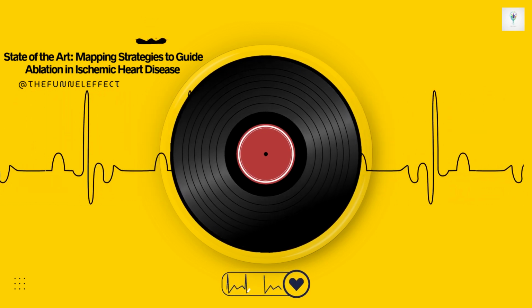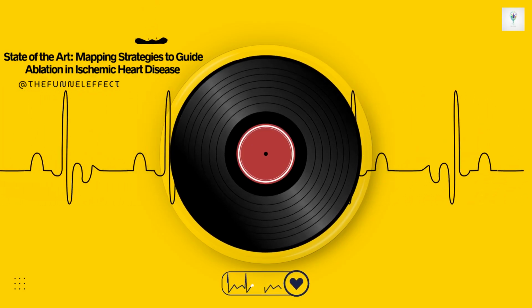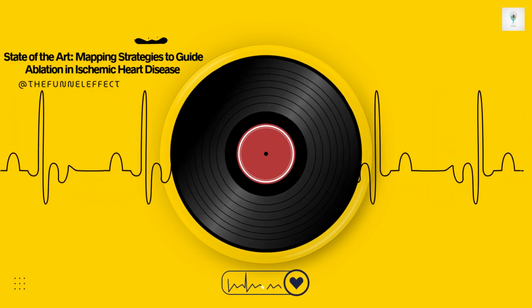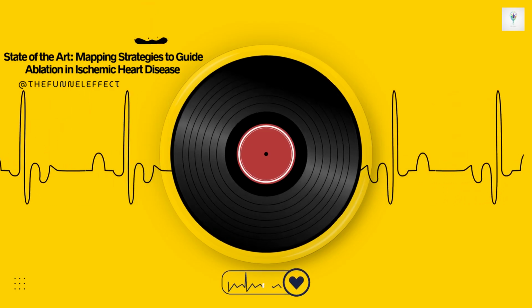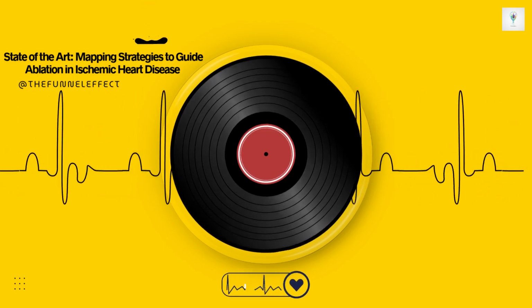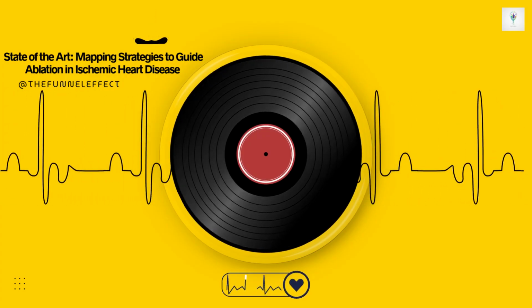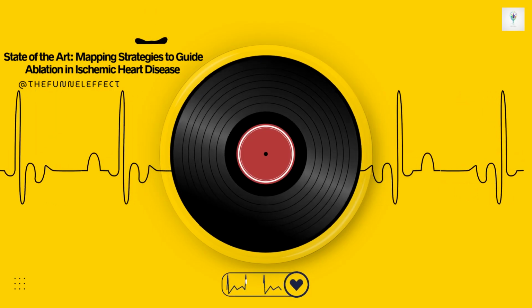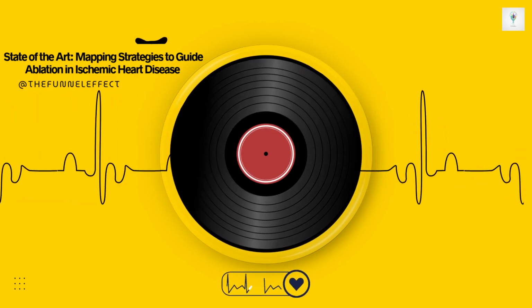And there's also the tricky issue of bystander pathways. Sometimes you can get perfect ECF from a site that's in a slow conduction channel connected to the main VT isthmus, but not actually essential for it. Ablating that bystander might not stop the VT. You still need to find the site within the true isthmus that gives you the best combination: PPI matching VTCL, concealed fusion, and ideally mapping the shortest SQRS, the exit, or the full SQRS gradient. Okay, lots to keep track of.